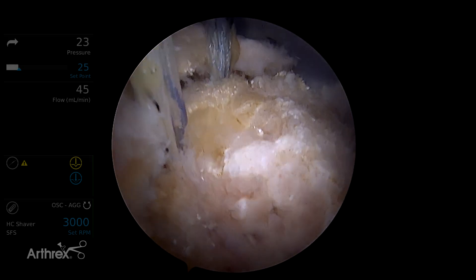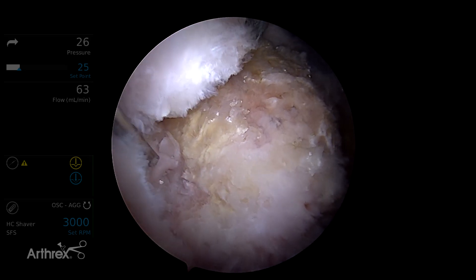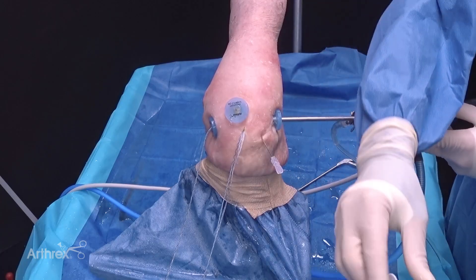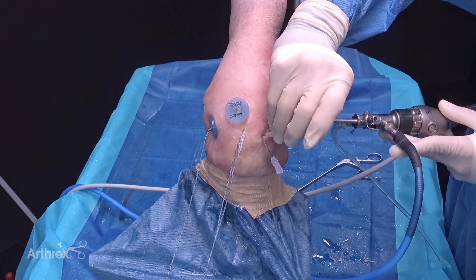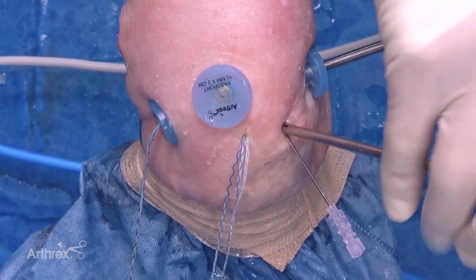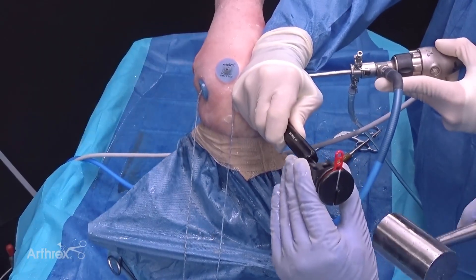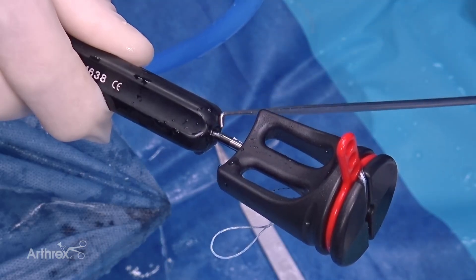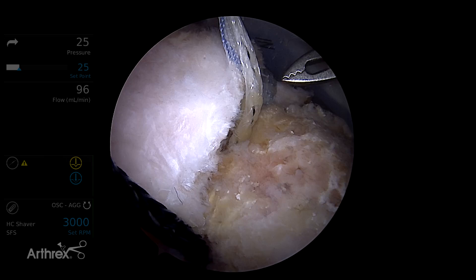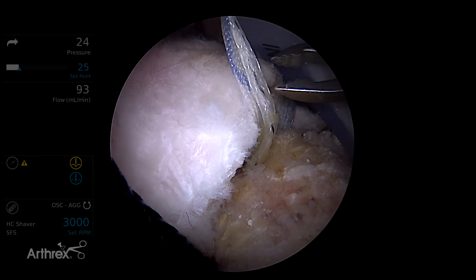Finally we're going to place our posterior anchor through a percutaneous portal. In this case we will use a guide. A spinal needle is used to determine the adequate angle of approach. We make a stab incision to help introduce the guide. Now we're going to reference the marks closest to the handle to confirm adequate depth of insertion. At this point we have all three medial row anchors placed and we have the option of incorporating the suture tapes within each anchor sheath.